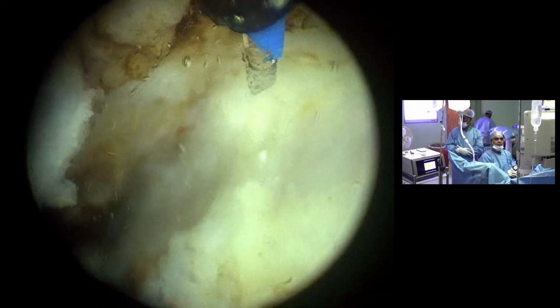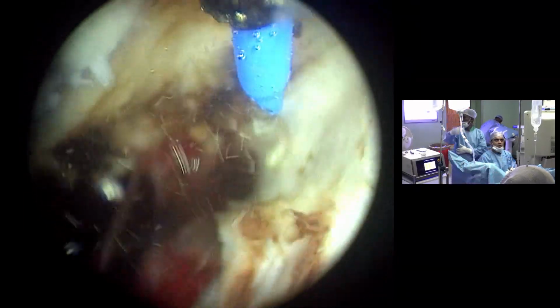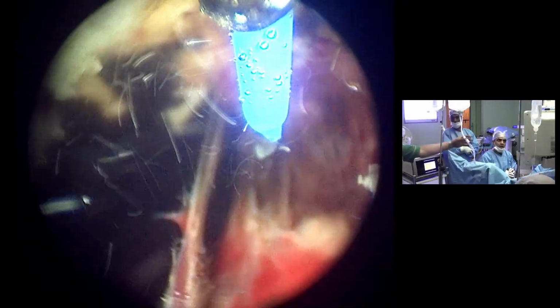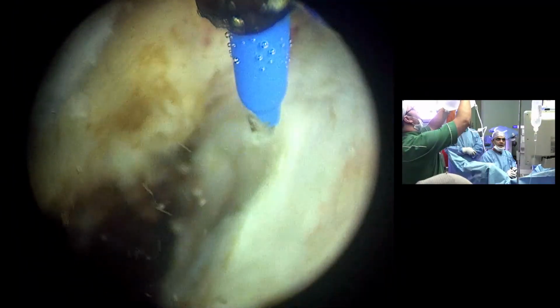A bigger bleeder will be an issue. So better to let the adenoma fall on the bleeding and wait for some time, and then you can come back. So this is what we are trying to do.